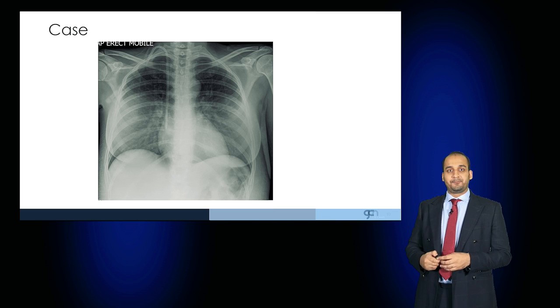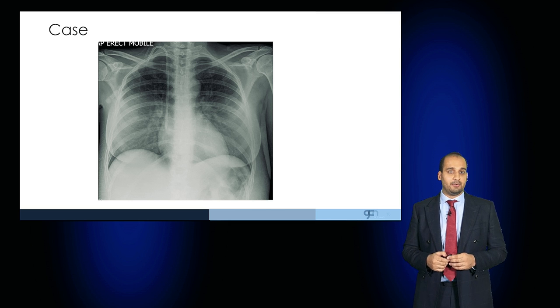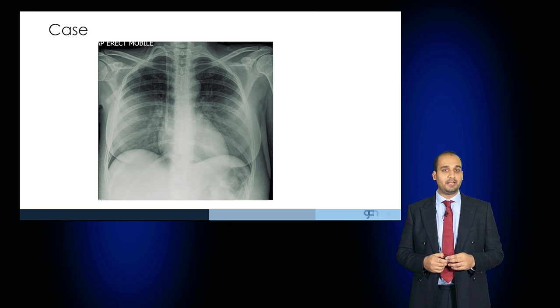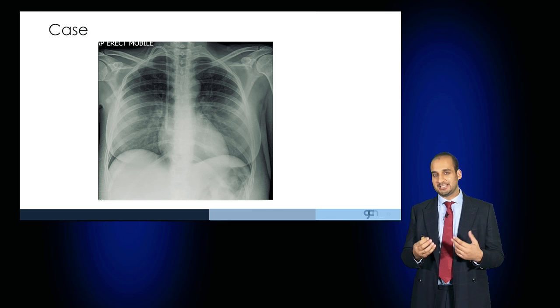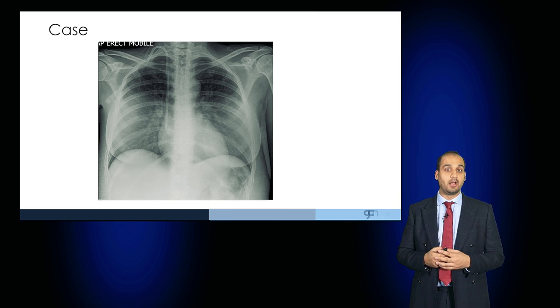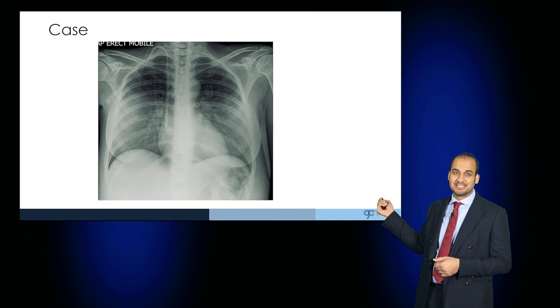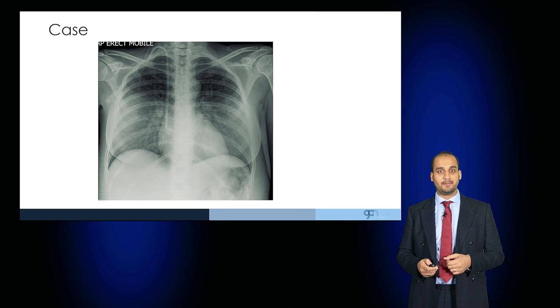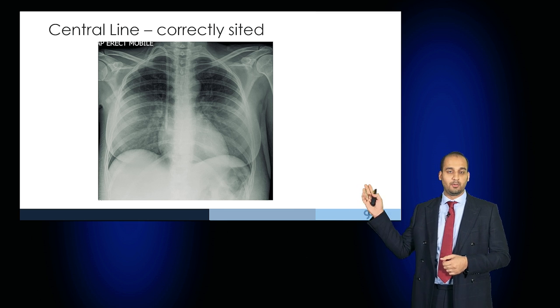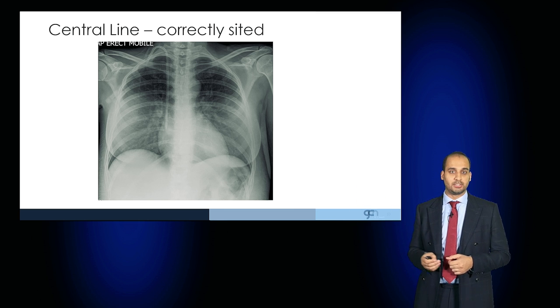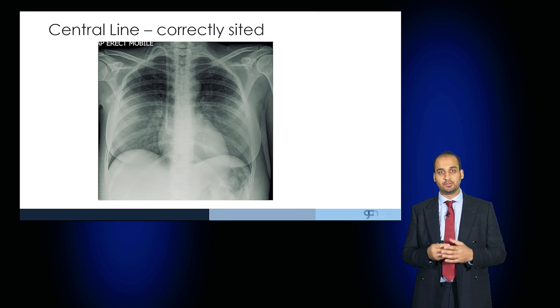Now have a look at this patient. This is an AP erect mobile film, which would suggest that the patient was relatively unwell. The key finding is the siting of a central line, and this is correctly sited where the tip is just superior to the right atrium.